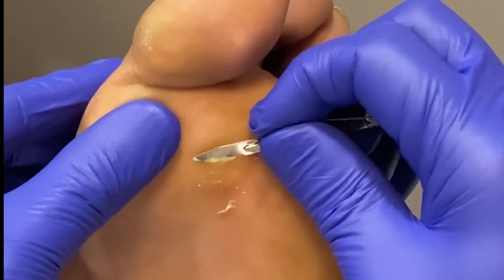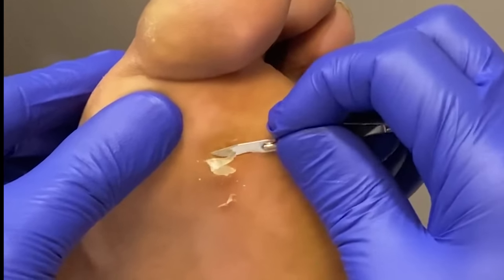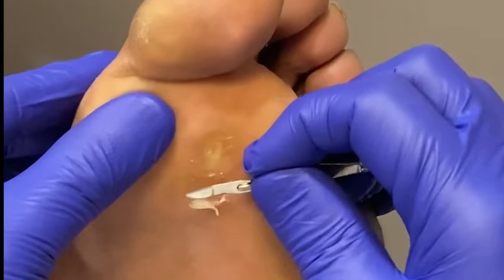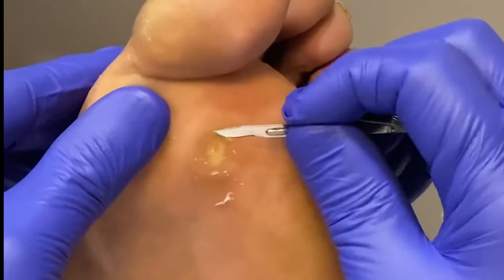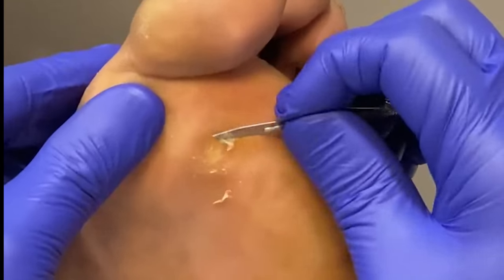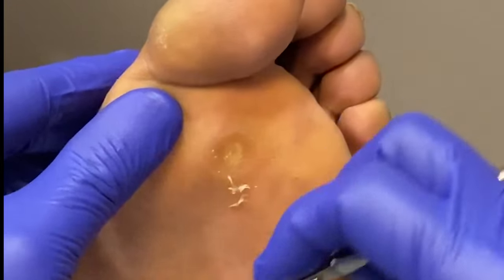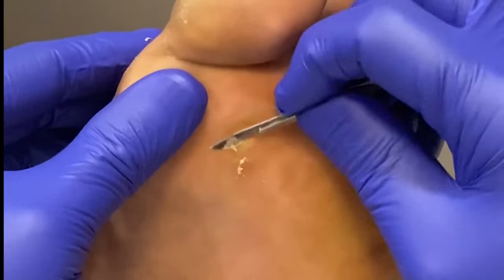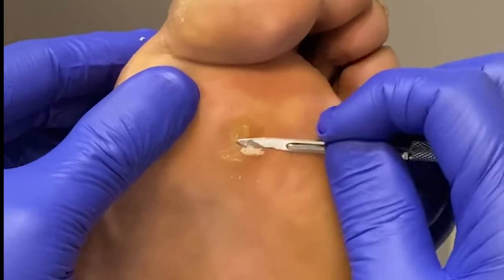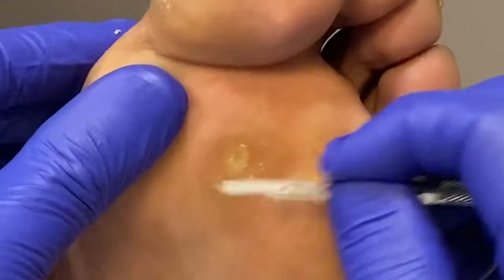Here I'm trying to carve it out as gently as possible, making sure that we're not trying to go too deep. With that 15 blade — that is a surgical blade, by the way, the same exact blade I use in surgery to make incisions — you have to be very, very careful. This is definitely not something that anyone should attempt at home. You should only see your podiatrist to have this done.